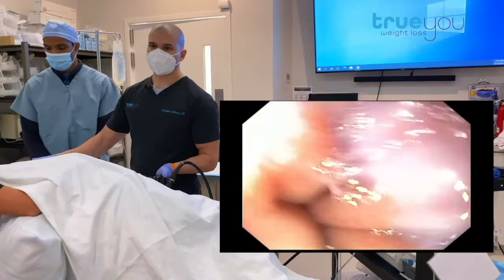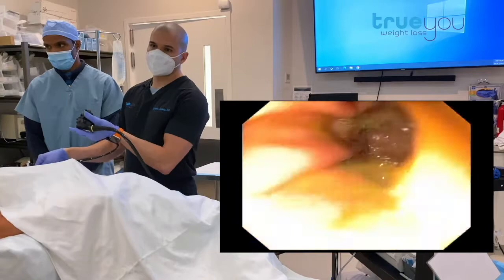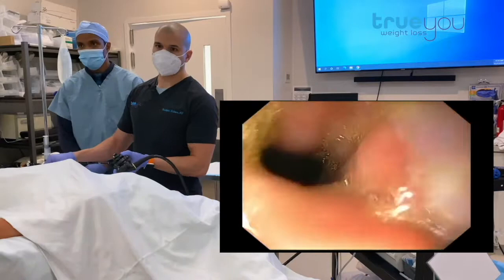She's been NPO, or has had nothing by mouth since last night, so we can ensure her stomach is completely empty. We're just going to take a look at the entire thing — nice, healthy stomach. We'll take a look at the lower esophagus. No real hiatal hernia, so she is a great candidate for this.